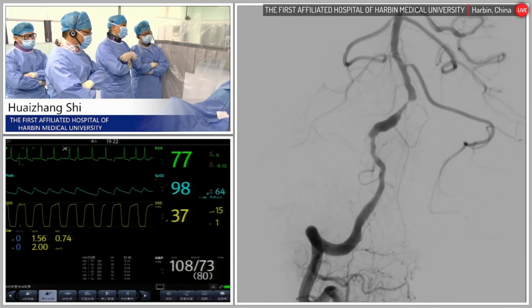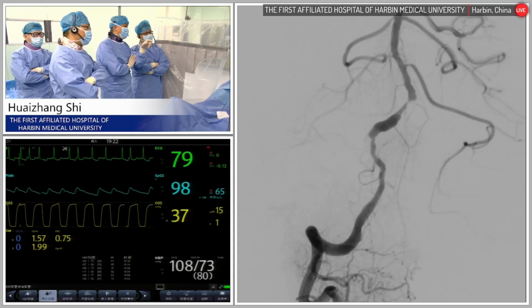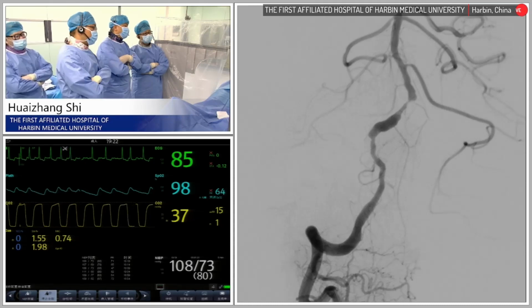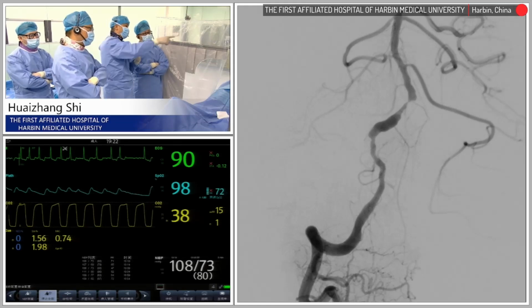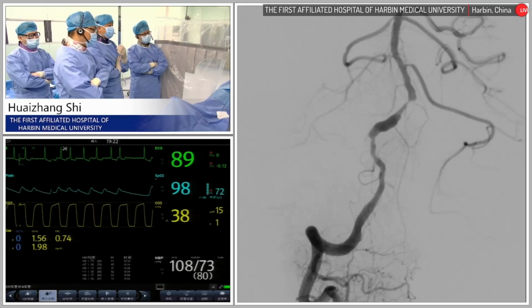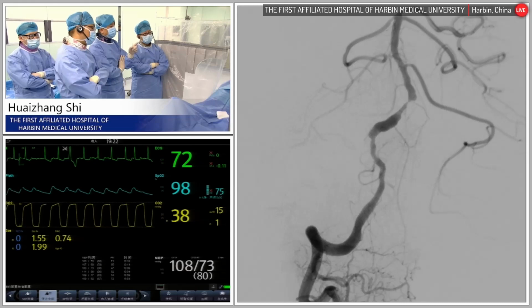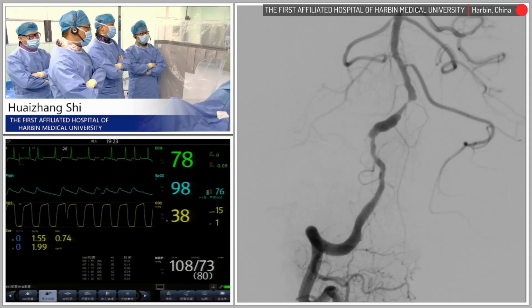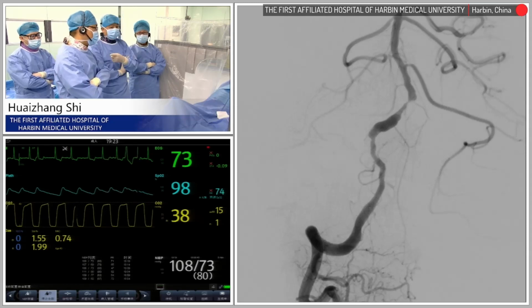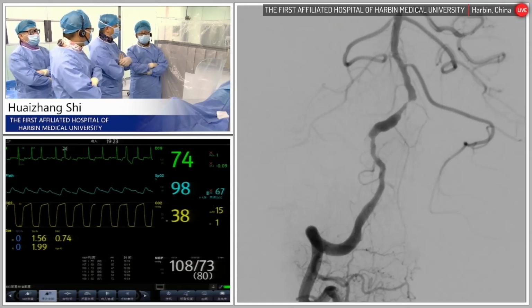The first one is close to the junction and is very severely stenosed, and the second one is this one. So we should put two stents in this patient. For the first lesion, we will use a new instrument, Fastunnel. It's a product of a local Chinese company.